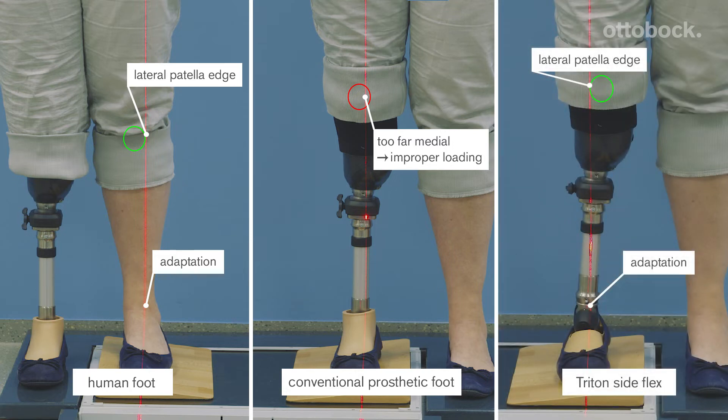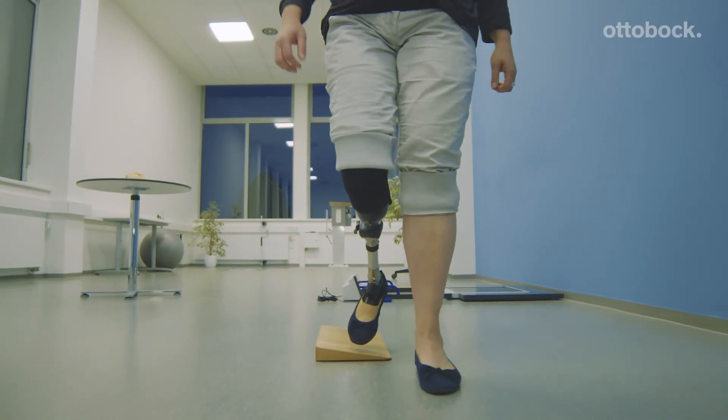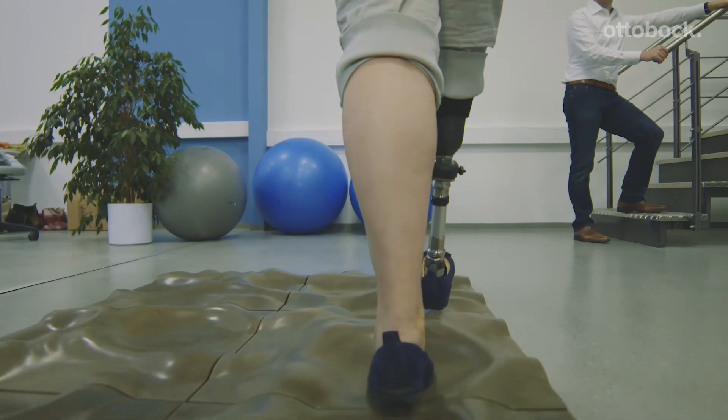The Triton Sideflex is designed to have a similar effect to the human foot. This leads to a more natural loading of the knee joint, enhanced ground contact, and fewer compensatory movements. This functionality is not only during standing but also during motion — it really compensates.